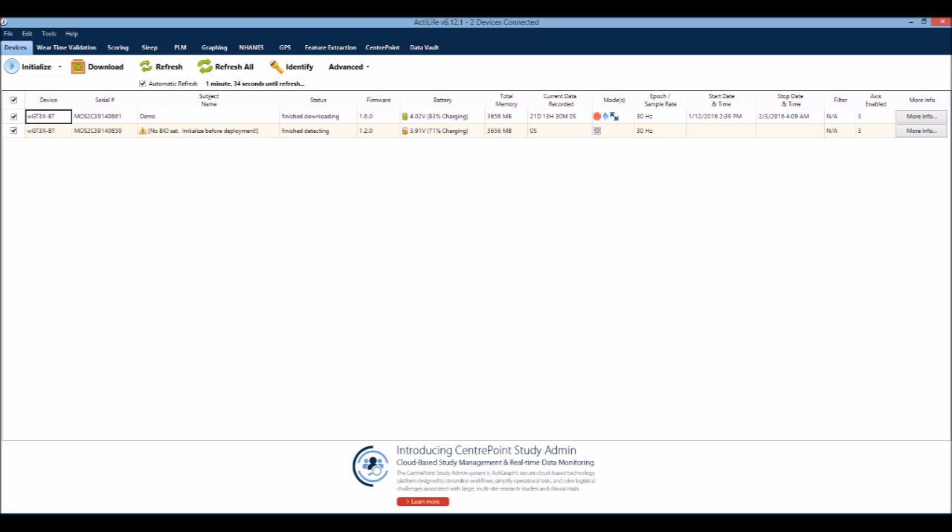After you plug in the ActiGraph monitors, you will see that they appear in the main screen of the ActiLife software. Make sure that the arrow to the left of the device is checked for the monitors you wish to initialize. Note that the device must have at least 80% battery life in order to be initialized.